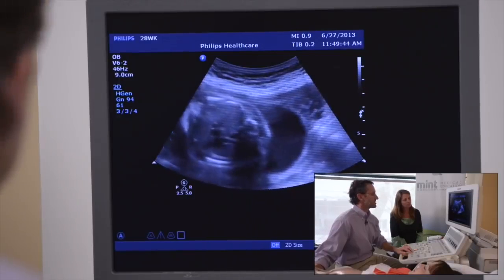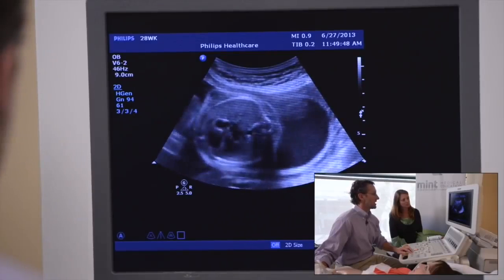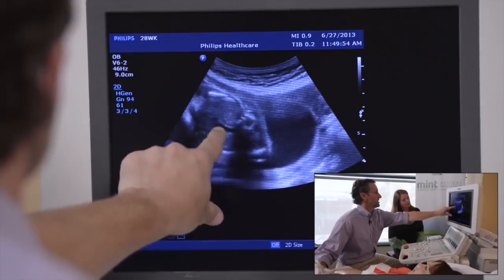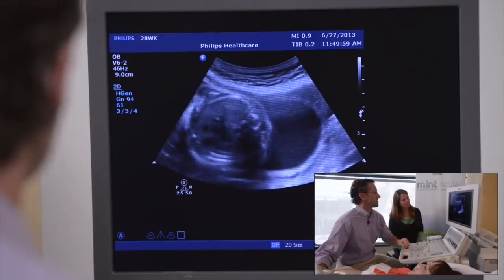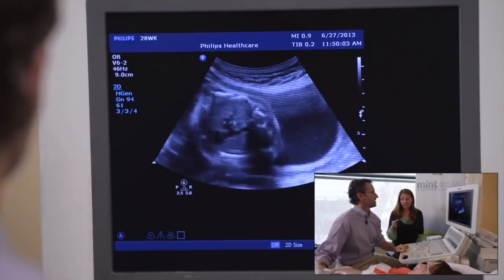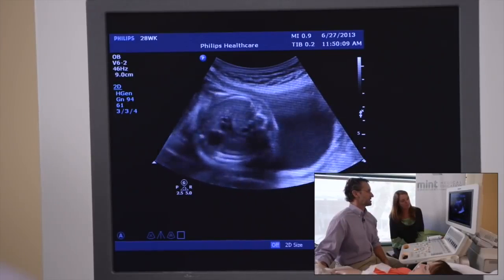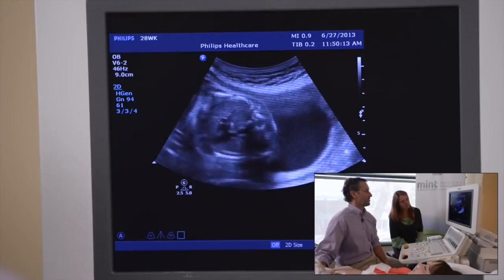But as I point out, as you scan up a little bit higher, you'll actually see that aorta will now cross over and go into the descending aorta. So there's the aortic arch, there's the ductus arch, and a little bit down more inferiorly. So all your hand did was slide perpendicular to the spine. I'm not even plane sliding, I'm just angling. That's just about 2 degrees of angulation.